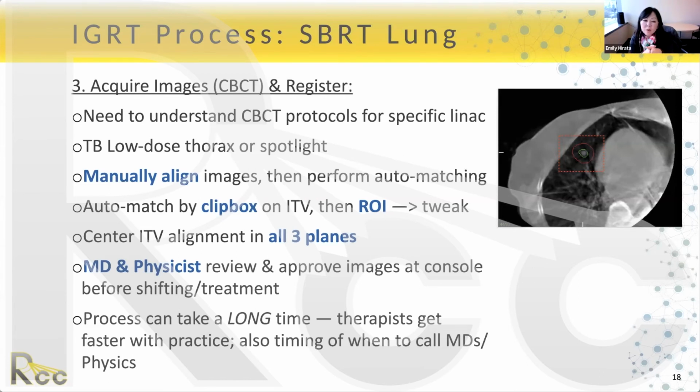And again, this is also why having the physician and the physicist there is really important to say, okay, this is a good match in all three planes. We can go ahead and proceed, because keep in mind, the patient is on the table breathing and waiting to be treated. And so all of this time of manual alignment, clip boxing, reviewing the images, having the physician and physicist look at the image, that's all taking place between the image acquisition and your treatment time. So that time can be a long time.